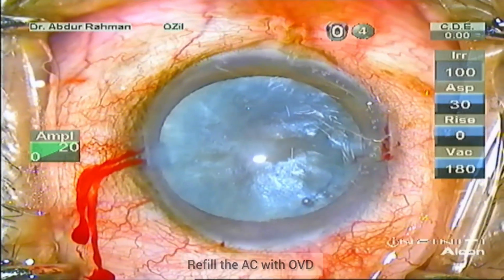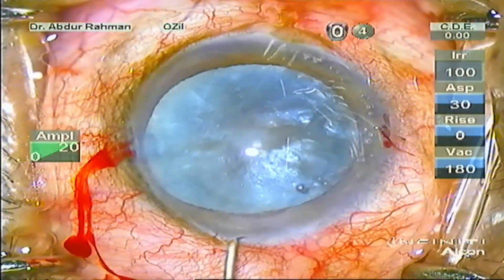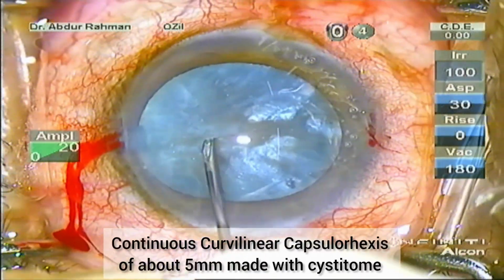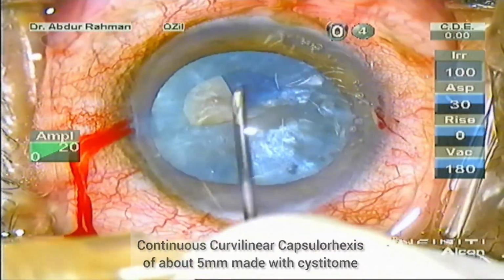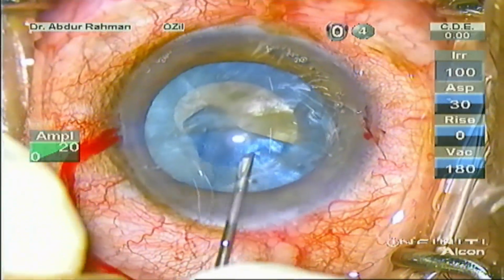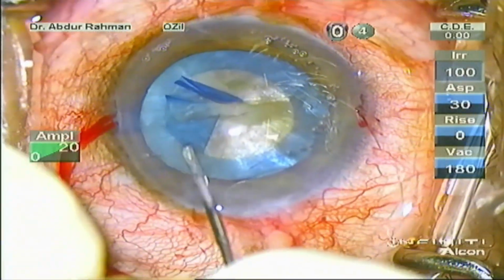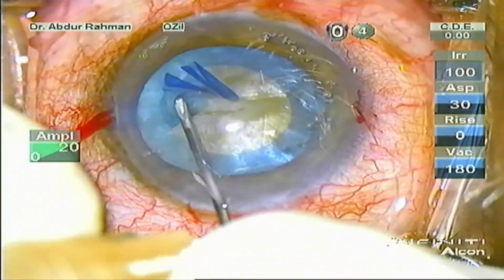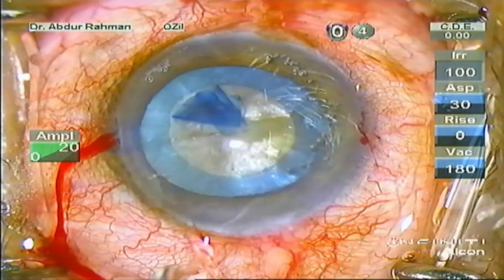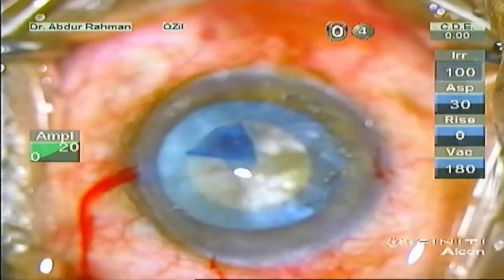Now refill the anterior chamber with OVD to flatten the anterior capsule and commence with the creation of the continuous curvilinear capsulorhexis with the help of a bent cystitome. Yes, a beautiful capsulorhexis of 5 mm has been created.